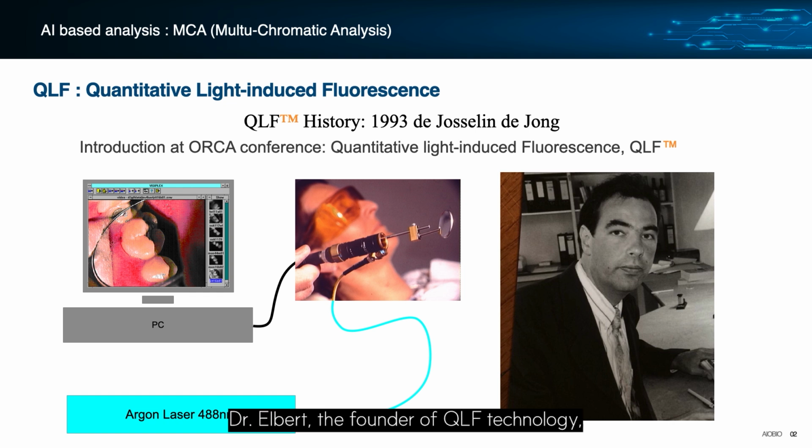Dr. Elbert, the founder of QLF technology, emphasized the Q in QLF, meaning quantitative, or the ability to measure changes objectively.